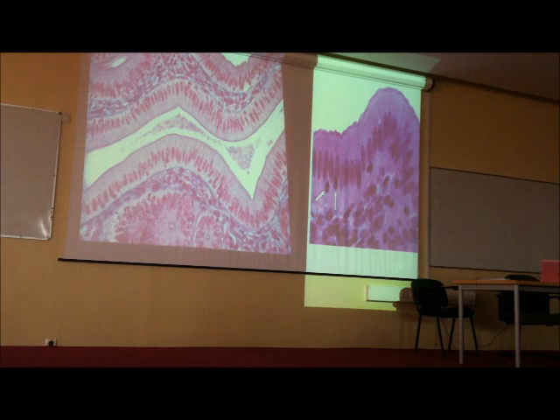Another picture for simple columnar epithelium. The same type of questions may come. Okay?